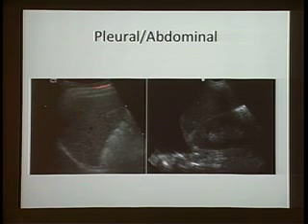You're going to see a structure that is basically big. If you're on the right, that's going to be the liver. And you may be able to see the kidney as well. Important structure, because you can rule out the patient not making urine. You go here, and then you see a dilated kidney with hydronephrosis. That's easy. That's very nice to do, okay? Or you may see fluid in between here, the Morrison's pouch, and then you say this patient is having a collection of fluid inside the belly, okay? It can be ascites, it can be blood, depending on the clinical context of what you're doing. So it's very, very powerful.